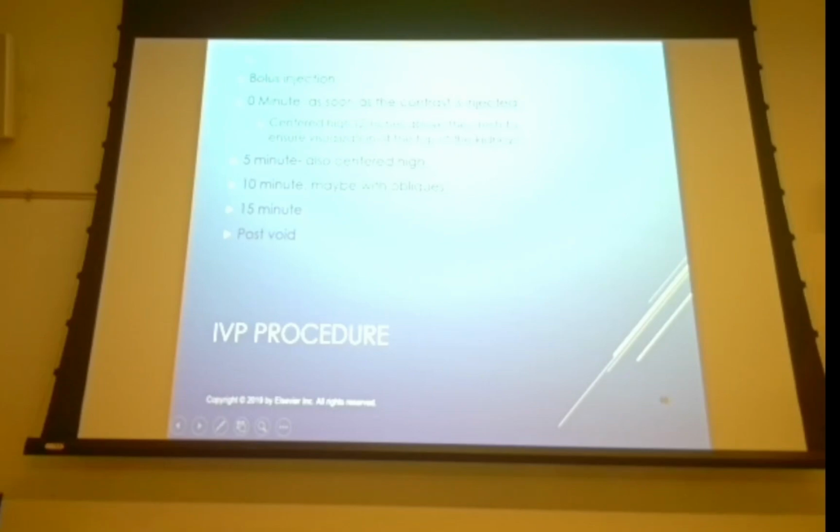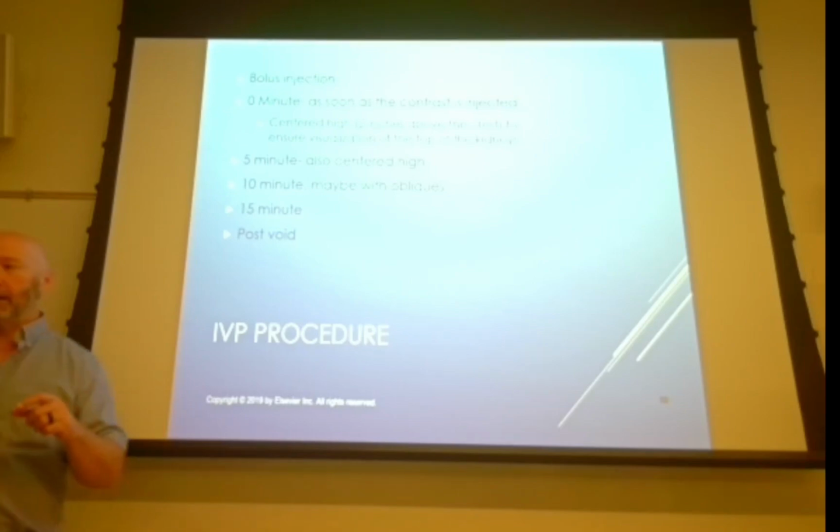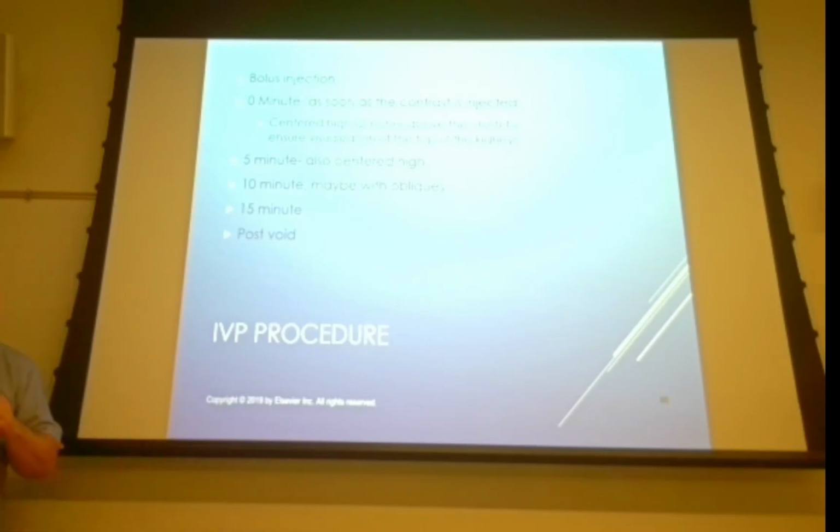Okay, so bolus injection, what does bolus mean? Any idea? What that means is you just push it as hard and fast as you can go. Okay, so the patient's probably going to have a smaller gauge needle in their arm, and if they've already got an IV started, they're going to have a smaller gauge needle in their arm. You're either going to have a Luer lock, which is a twist-on thing, or you're going to have a port that you can stick into.